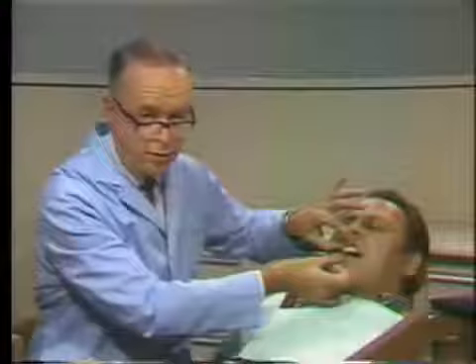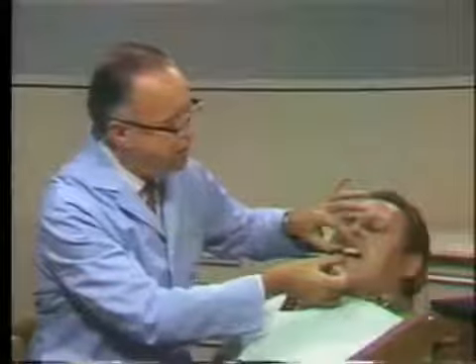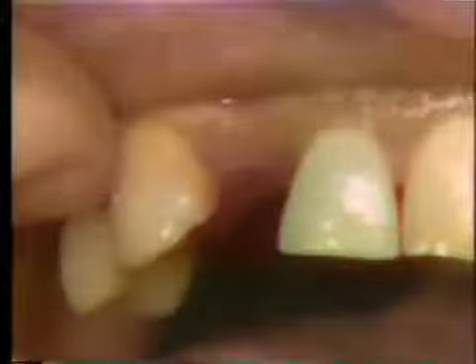Anywhere else other than a TV studio, we would perhaps change the lighting a little bit and see how it looked under daylight and so on, just to make a final check. But I think we can be fairly sure that this one will be within the range of adaptation during cementation procedures. So we'll make a note in the record to use shade 66. And that completes this particular part of the operation.